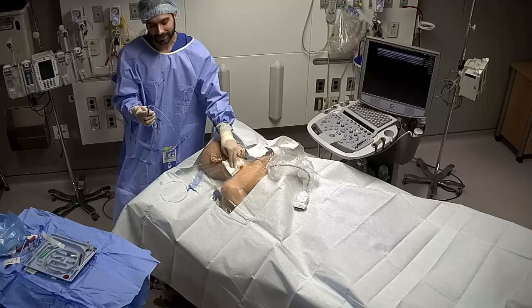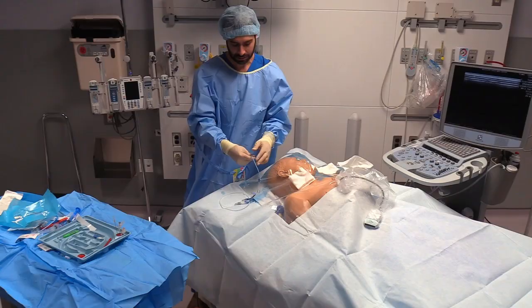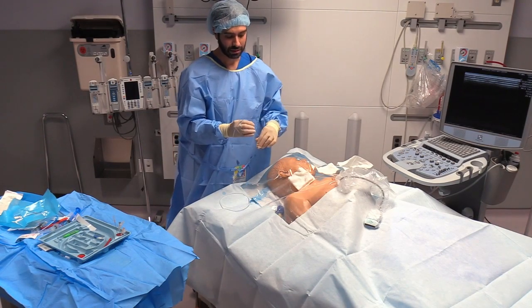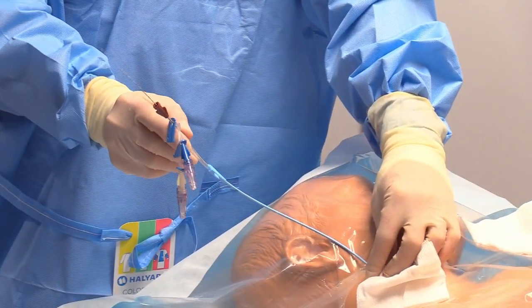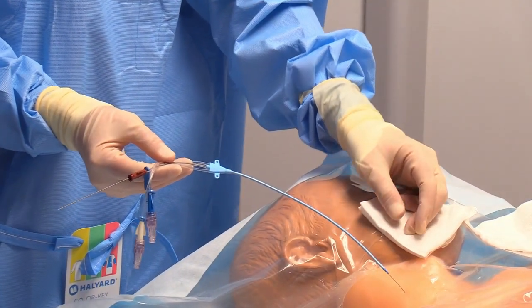If you've got a 20 centimeter catheter, you're going to go to like 15 or 16, depending on the patient's size. So at this point, grab the catheter here, slide it over. As you get close to the tip, in most patients, you're going to actually, like here, the wire comes out easily even before I get there, but in most patients, you're going to have this in all the way to 20 centimeters, and it'll be harder.